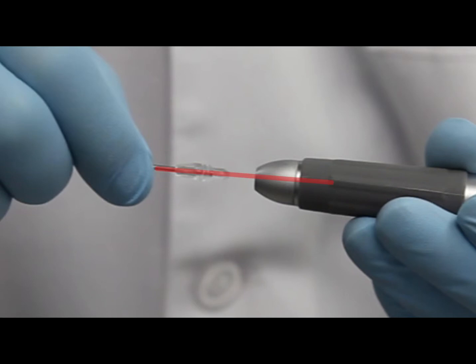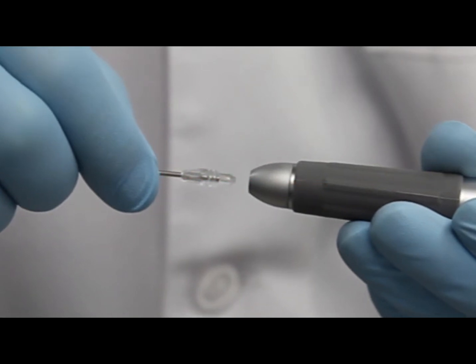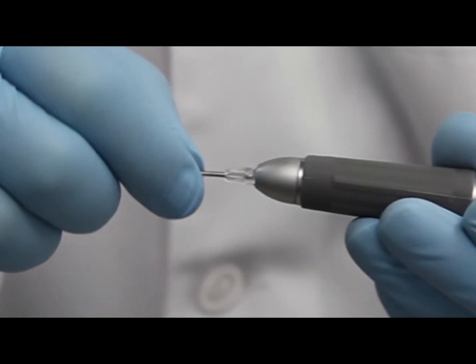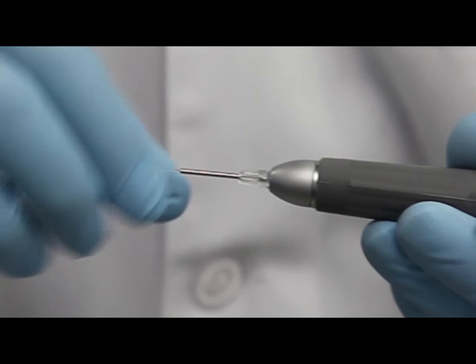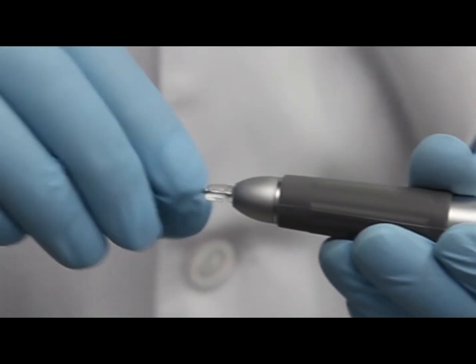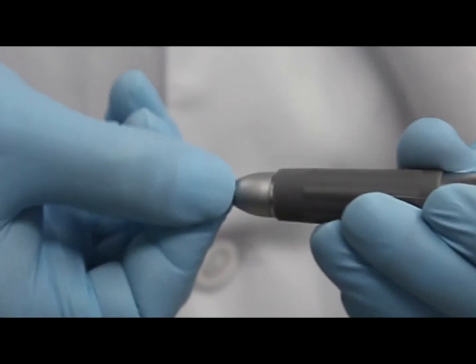With the tip and handpiece in a straight line, gently push the tip into the handpiece. Make sure the tip is not loose or angled. Then rotate the tip until no threads are visible.